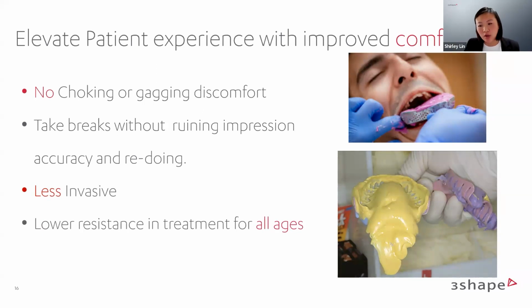And then just the lower resistance in treatment for all ages, because I know a lot of patients don't like doing physical impressions, and they would much prefer something more comfortable, like an intraoral scanner. So kids can be very apprehensive about alginate impressions, where you can just take a scan for them and it's quite easy for them to take in.